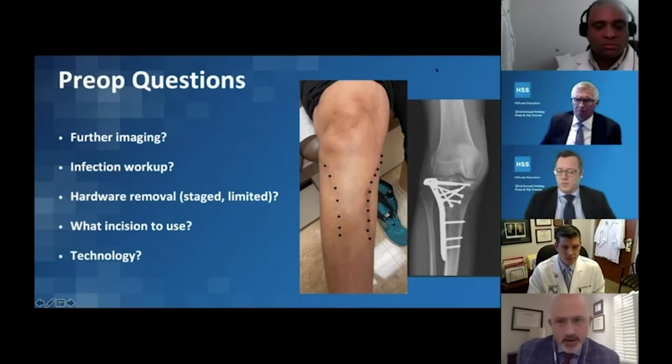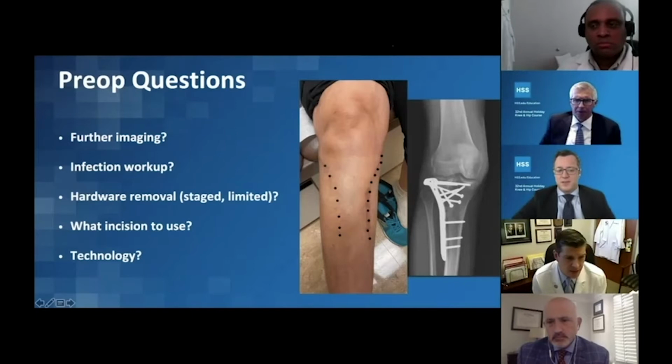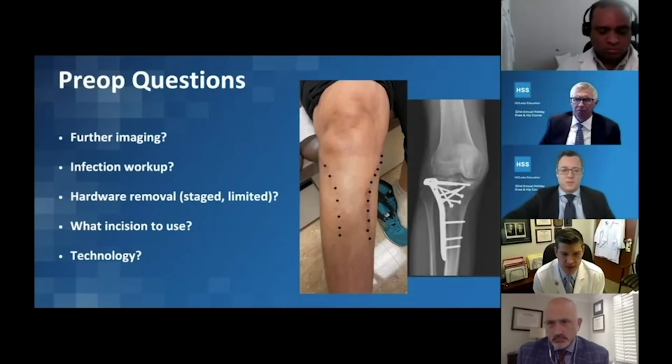I think I'm okay with the x-rays only. Brian, same thing? Yeah, I think the same thing. She's far enough out. I'm not too concerned about healing or having a big non-union over there. So I'm happy with just plain x-rays on this case. Yeah, I think that's a good point. Sometimes we see them within 3-6 months where you might be concerned about fracture pieces not being united. Then a CT scan might be helpful.